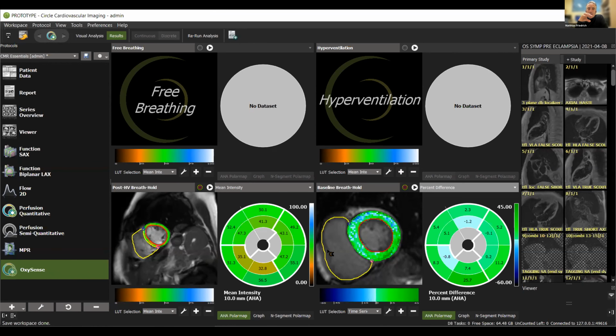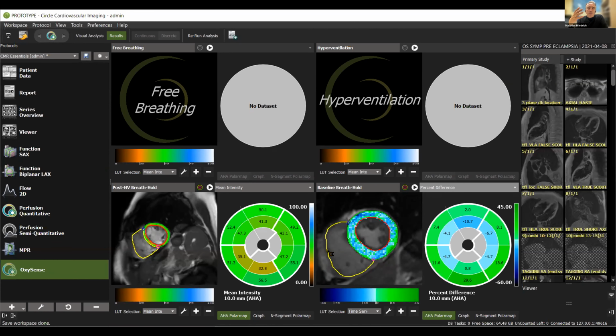So people may think, okay, these fluctuations over the cardiac cycle. So the question is, what we see here, that during these fluctuations, there are certain areas that basically fall below the threshold. What is your first impression of these fluctuations in healthy people? Do they never, or do they occasionally also fall below that? Or is this something that we, as soon as we can see some blue here, that, and I understand we're all early here, but we want to share this early experience. So what's your level of confidence that these fluctuations going to the blue are actually reflecting an abnormal vascular response, heterogeneity, as you beautifully showed in your paper?